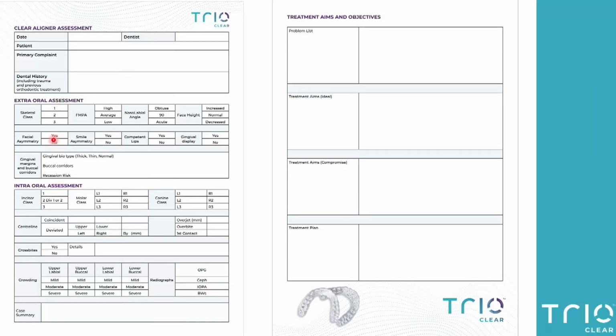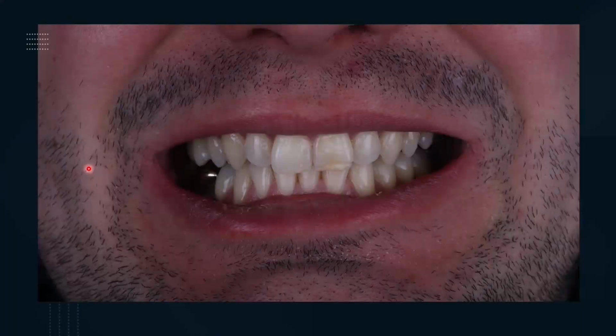Facial asymmetry here. Everybody has asymmetries in their face, and this one is no different. You just have to spot it. Always tick yes to that. And then try and see where the asymmetry is. So here, asymmetry here, and then we've got this asymmetrical laterals. This guy's not far away from symmetrical. We'll talk to you about the midlines in 1 second.